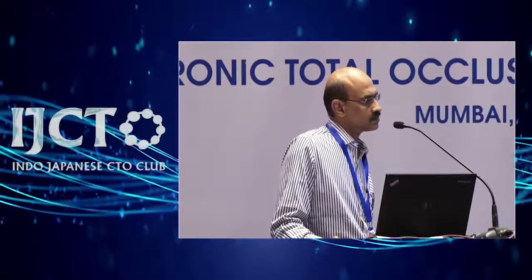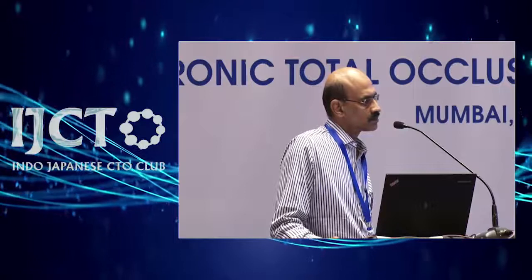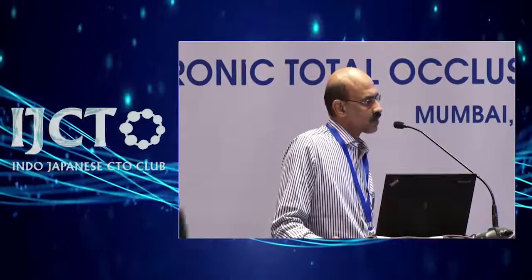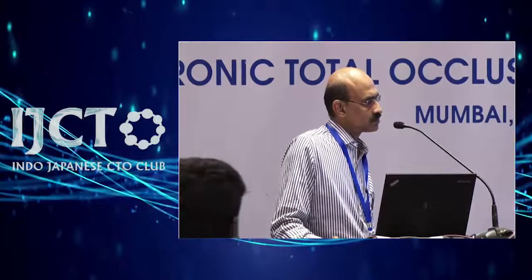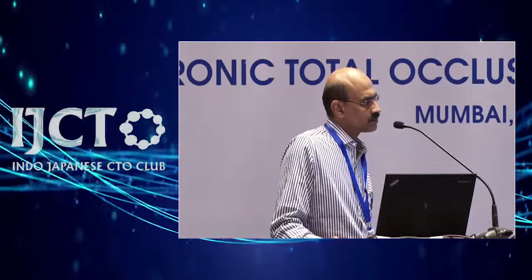You're right, absolutely. And I think in left system, the Guideliner is a great help, both for circumflex and for LAD. And you are anchoring only at 4 to 6 atmospheres. It's not very high. Small balloons.